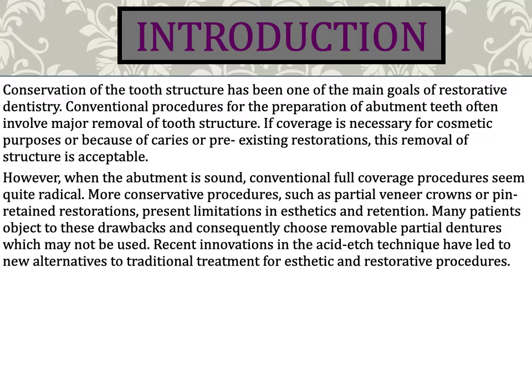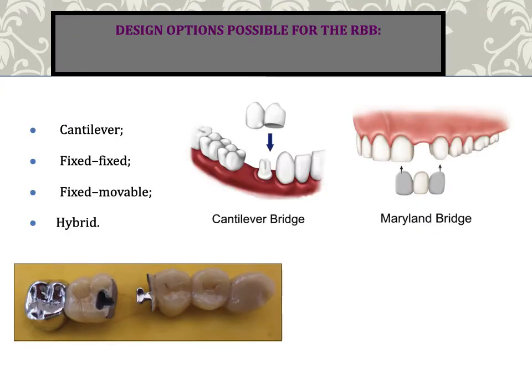So these minimal preparation bridges are therefore used when the potential abutments are unrestored or minimally restored and there is a need to reduce unnecessary tooth preparation. Design options possible for the resin bonded bridges are the cantilever bridge, the fixed-fixed bridge, the fixed-movable bridge, and the hybrid type.